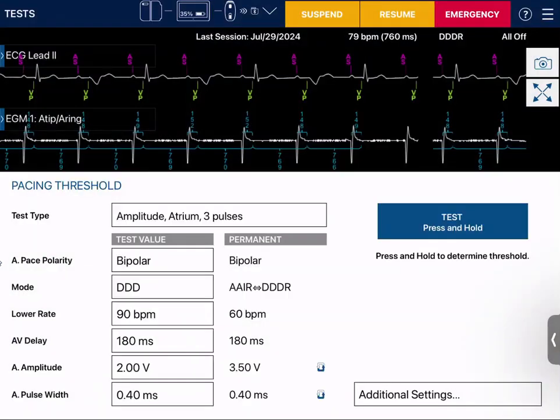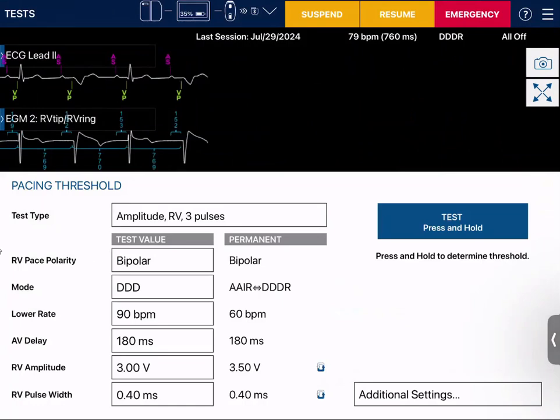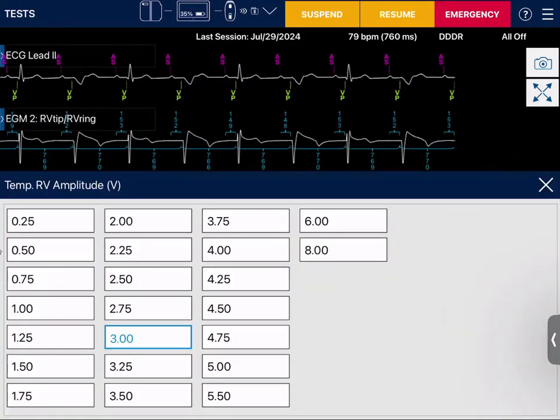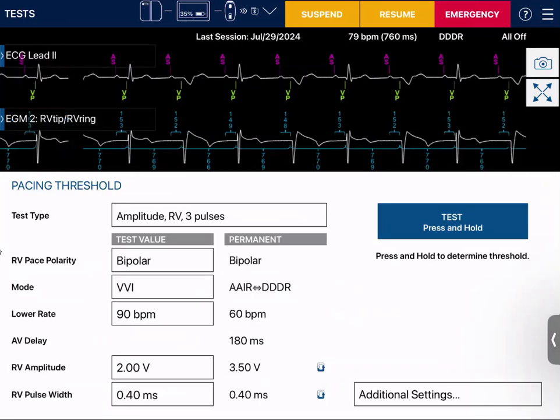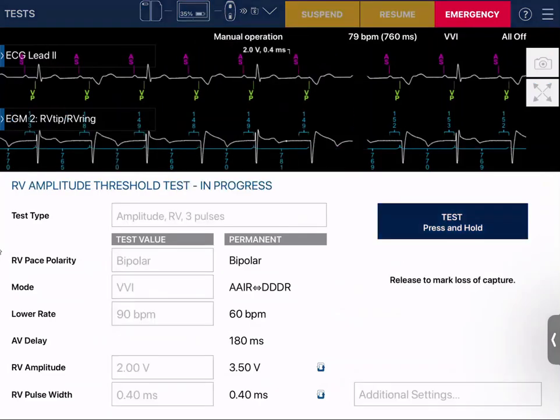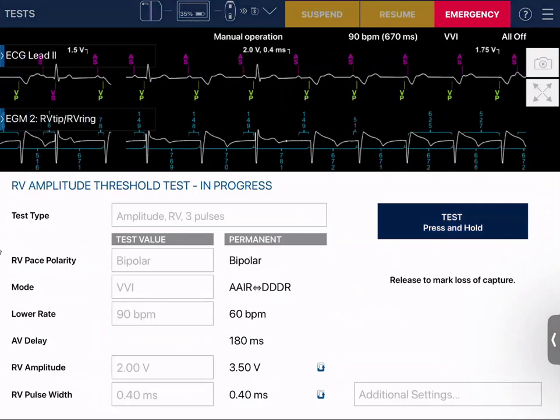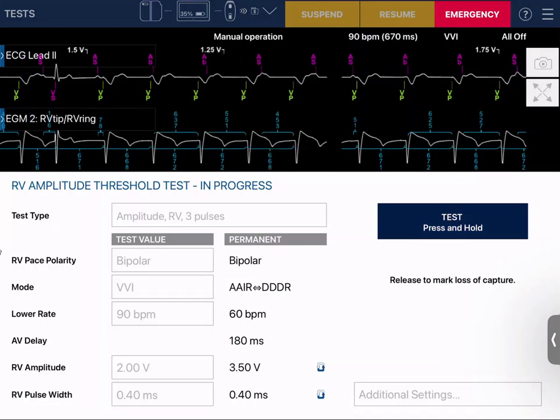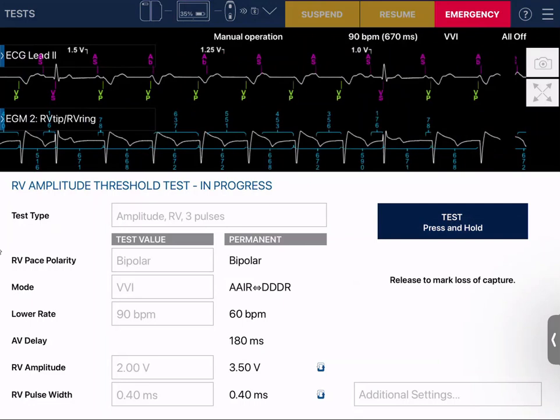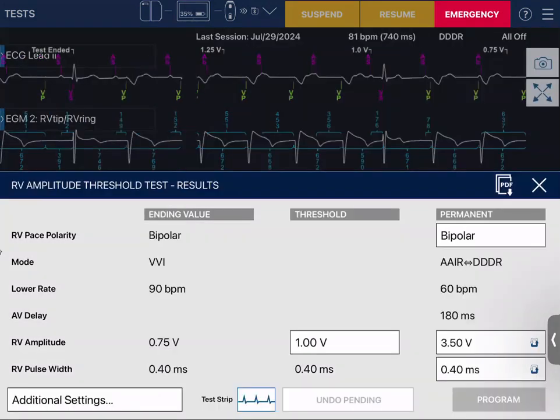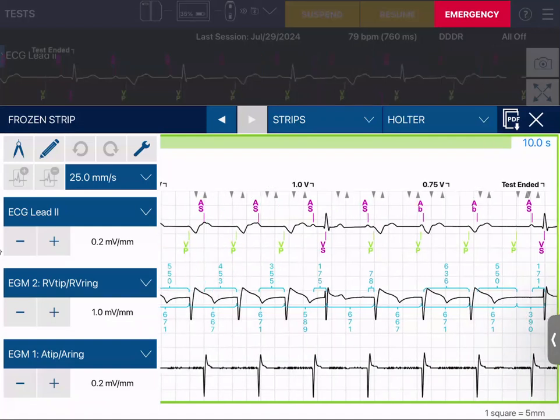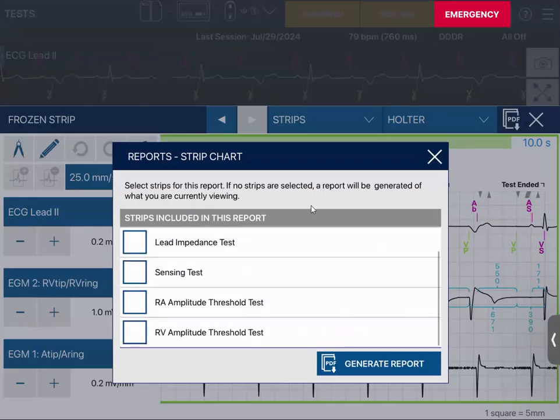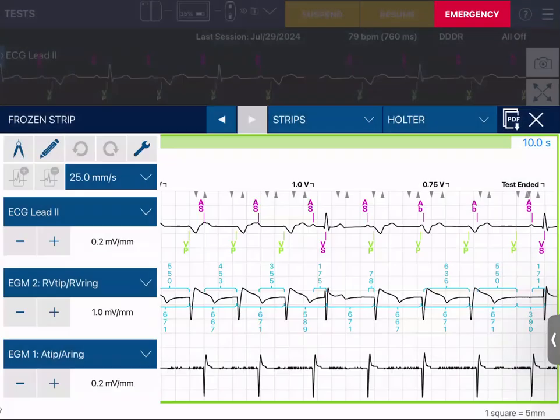Now I'm going to do my ventricular threshold test. I'll change the chamber to RV and run this in VVI since it's easier to see. Starting at 2 volts again, it's another press-and-hold test. The second I lose capture, I come off with my finger. I can see I lost capture at 0.75 volts — there was a V-pace with no waveform following it. I'll PDF this one as my RV amplitude threshold. My threshold loss was at 0.75 volts, so my threshold is 1.0 volt for this patient.